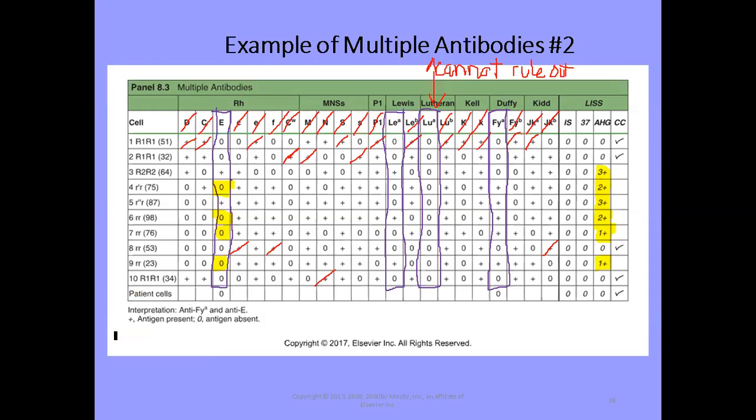So let's go and look at our Duffy. And I'm going to switch back to my highlighter. So far so good. Negative here, negative there. Okay, this one doesn't fit, because this is positive. But I'm going to let that go. Here is a positive that before we didn't have. Let's look at those. Here's a positive, which we have. Here's a positive that didn't get detected with our other cell, as is this, negative, and then a positive, okay? So hopefully this will make sense in a minute.